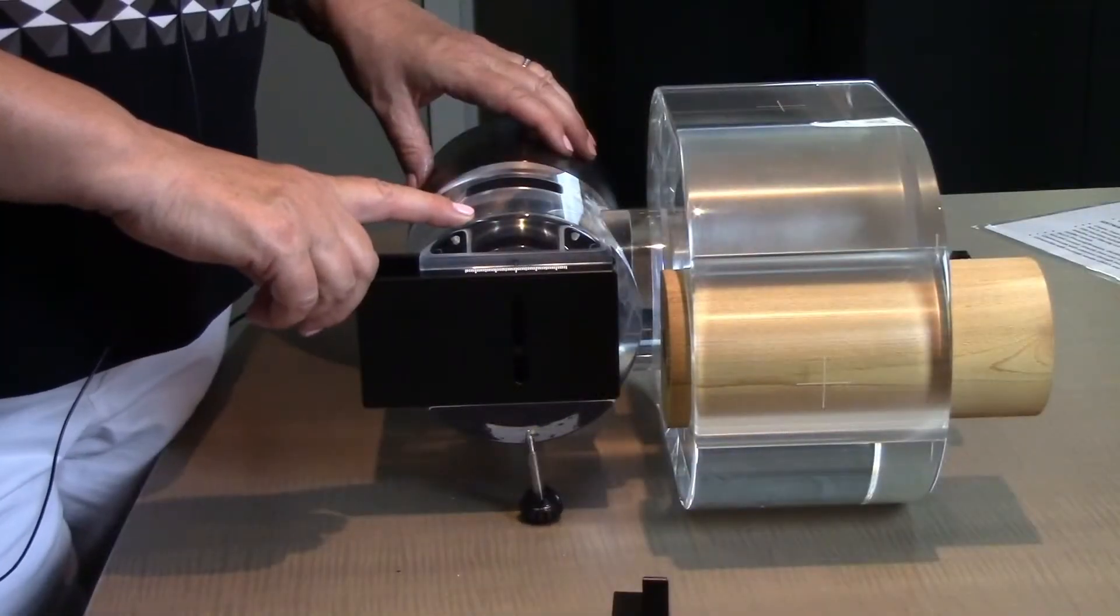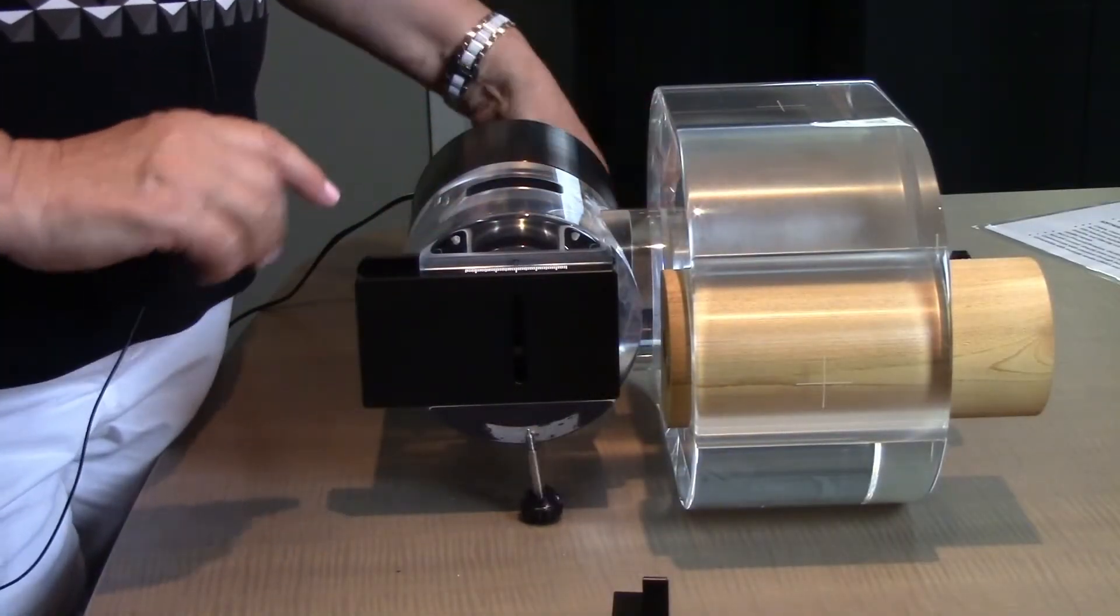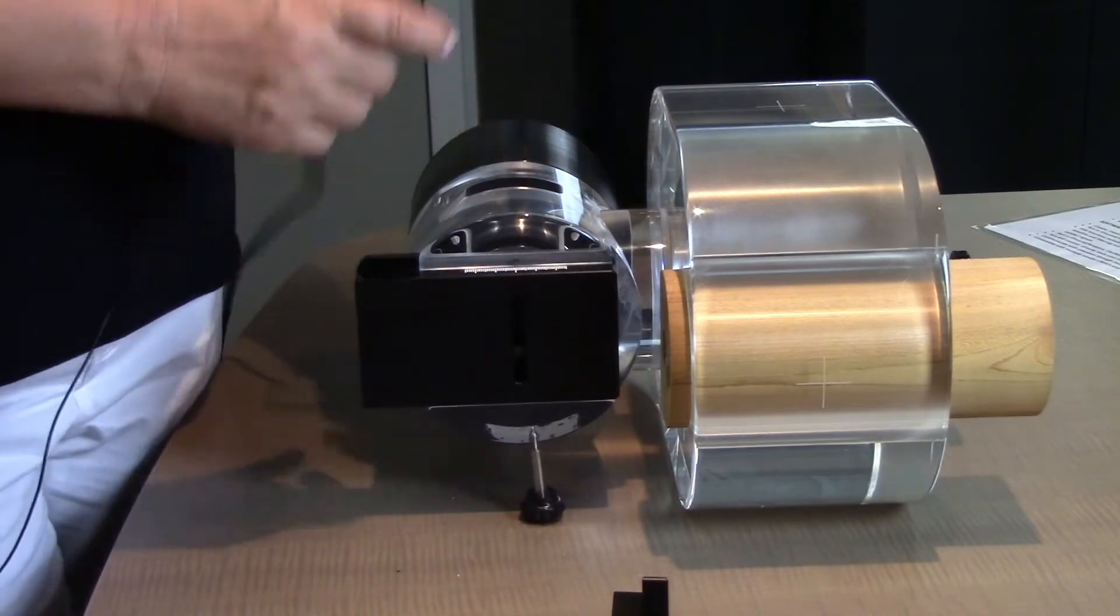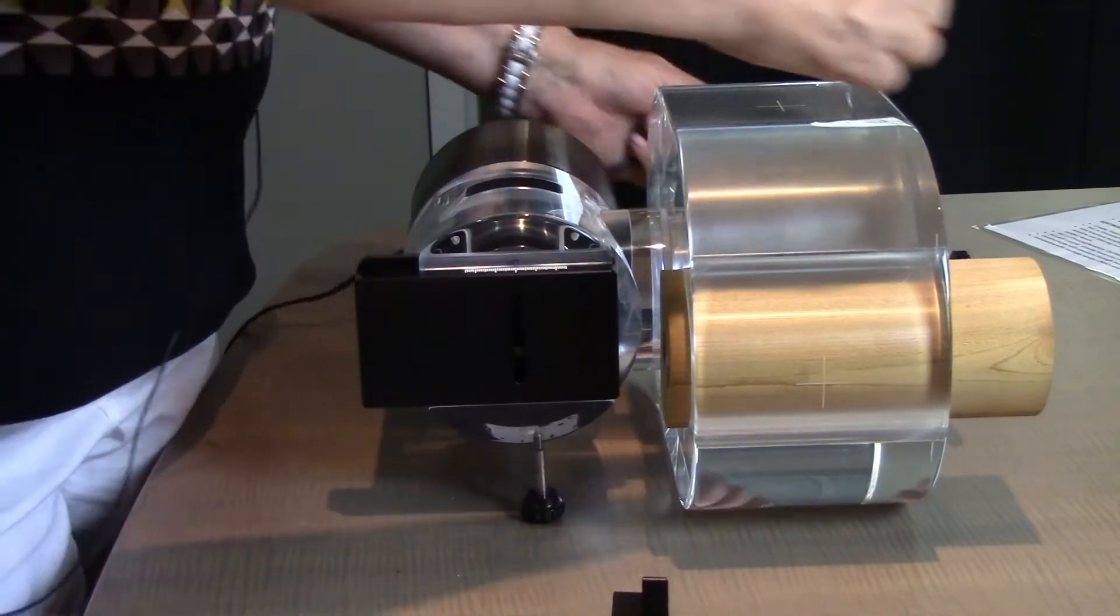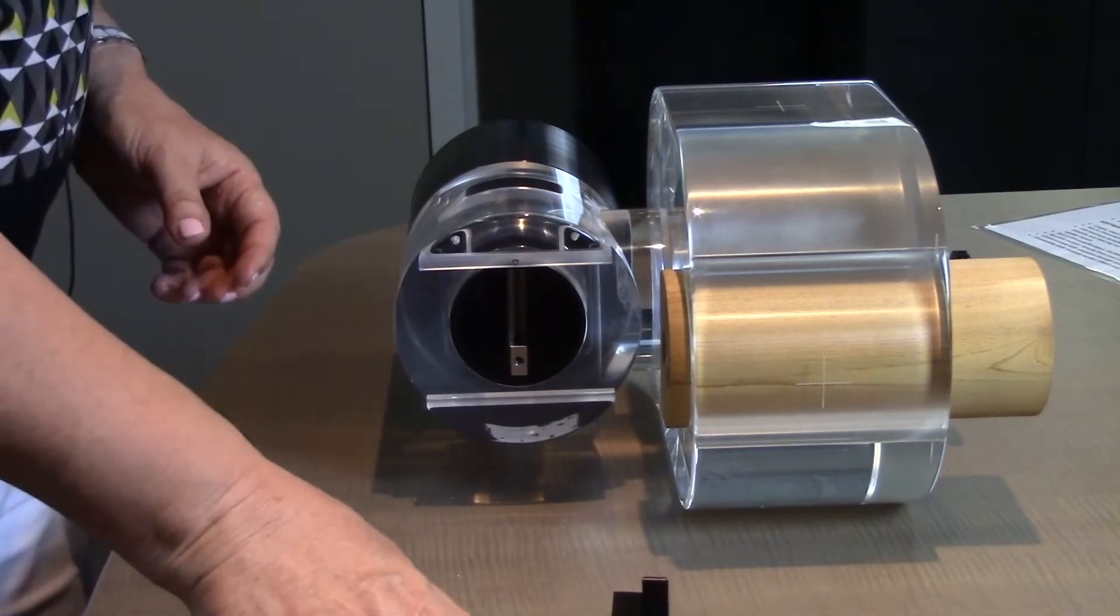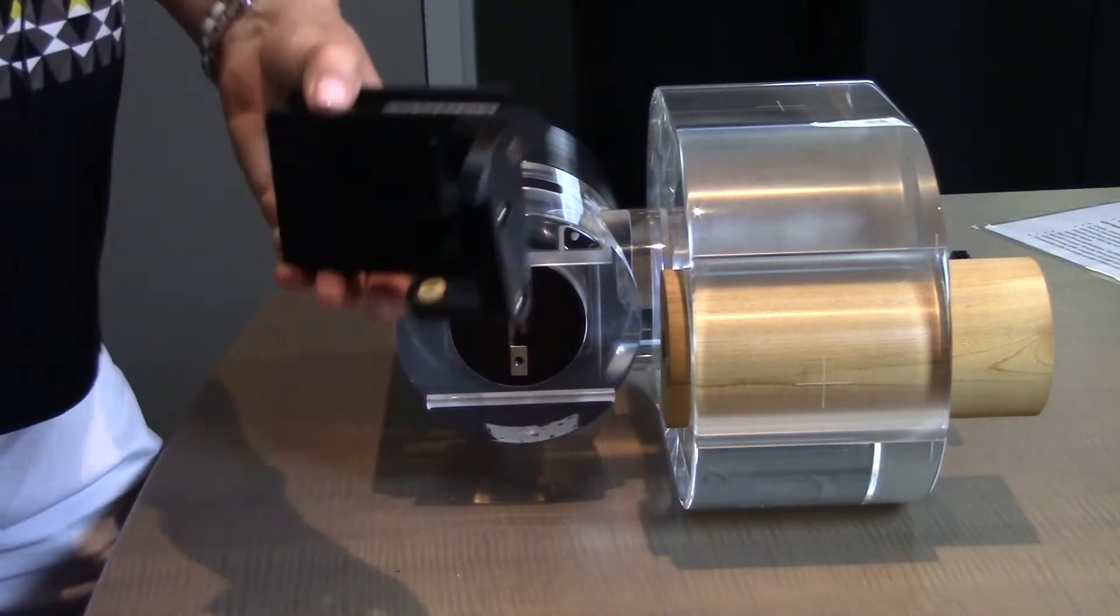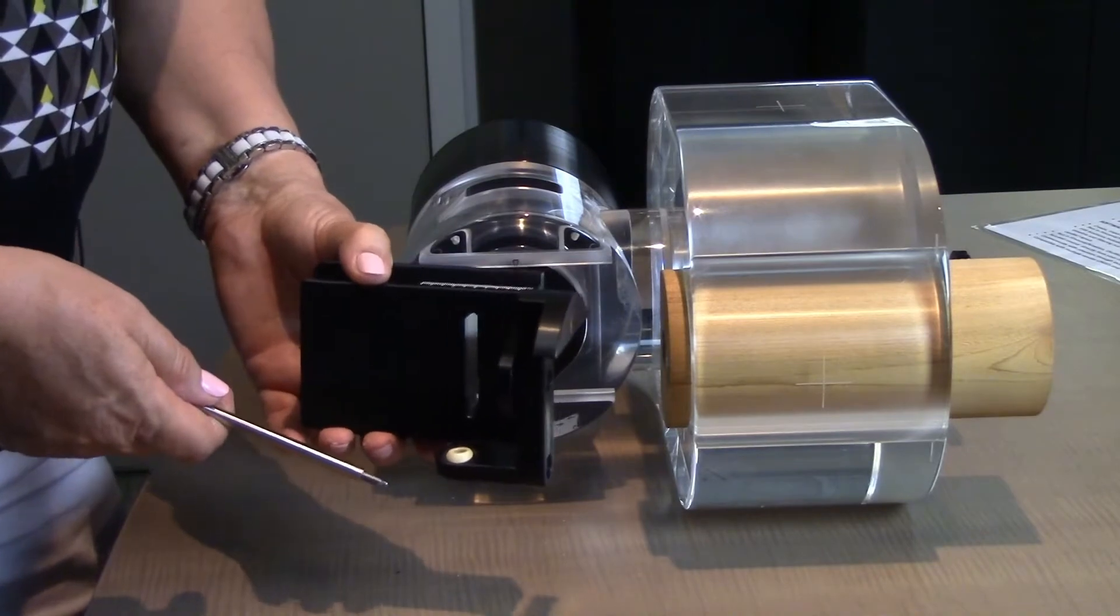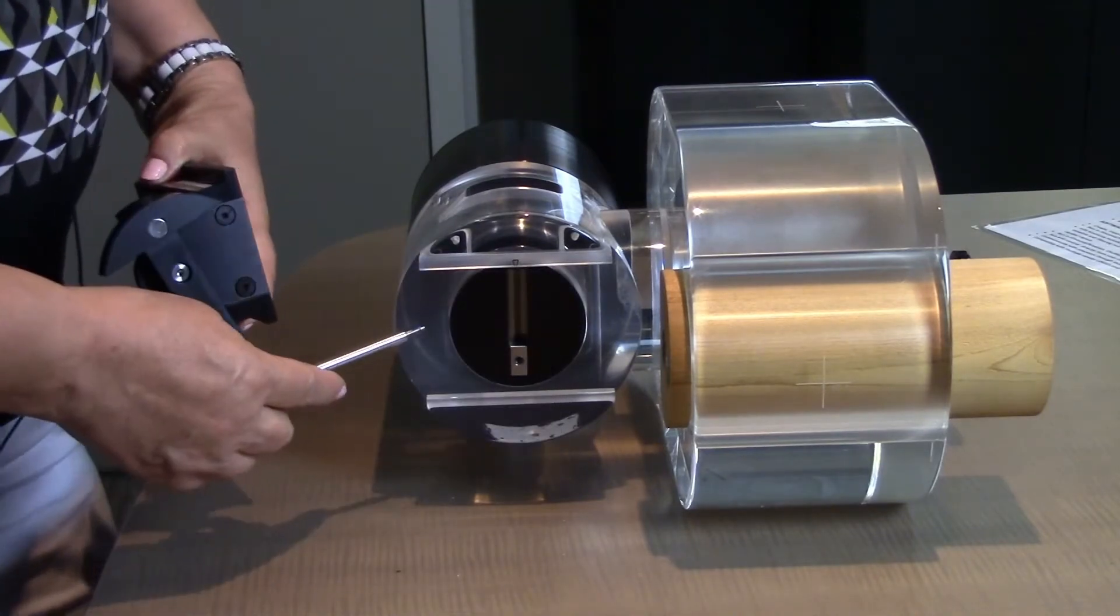Now we're going to look at changing the translation stage. The first thing you need to do is unplug the phantom so that it's no longer attached. Unscrew this and slide it out. Next, take your rotation stage and insert it here.